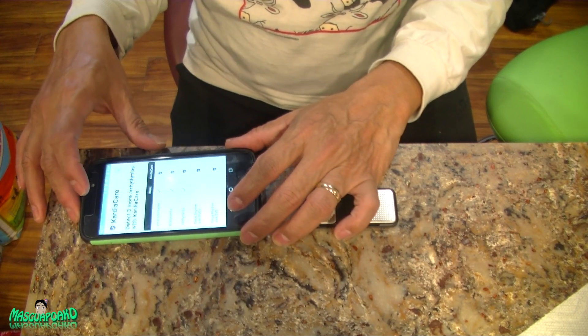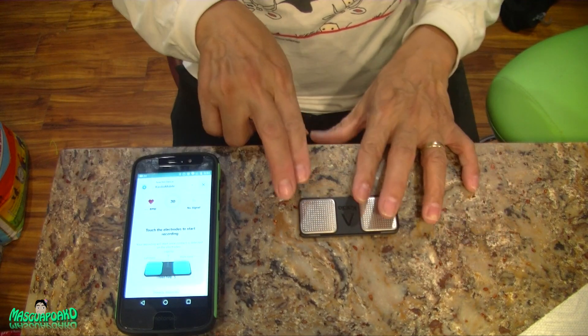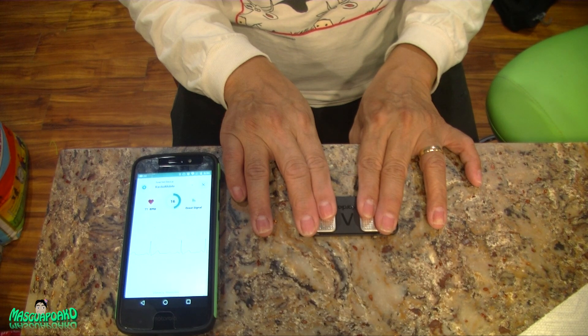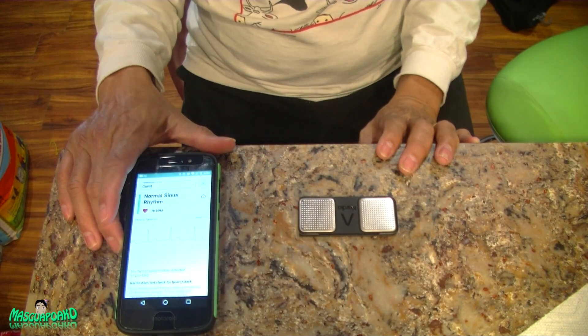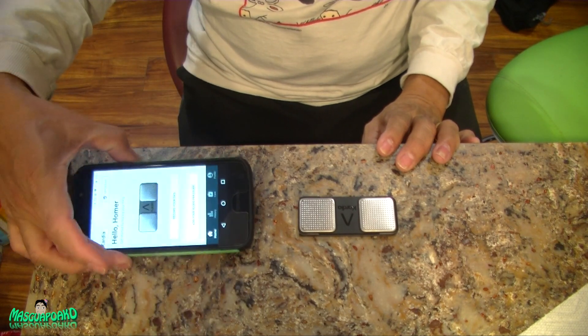I'm going to try one more time. Click it and start again — no, I don't want to upgrade. Start again and record with two fingers. Let's stay quiet. Seems to be working. Normal. Let me try landscape orientation — it doesn't show the long way, oh well.